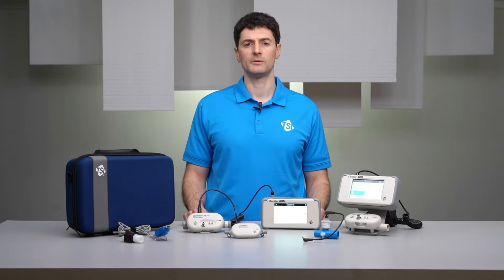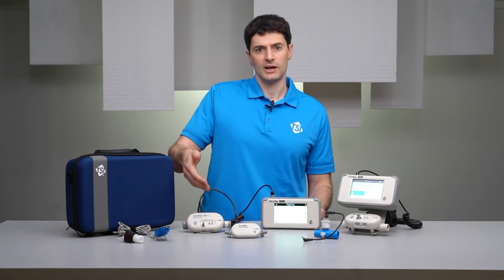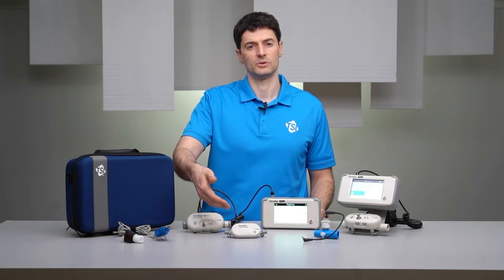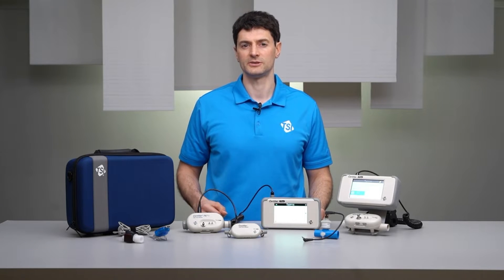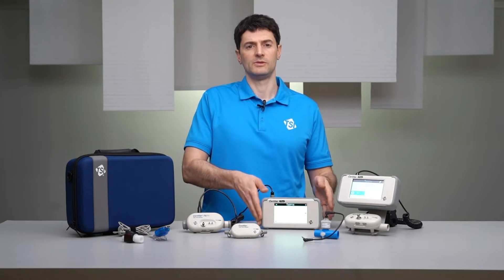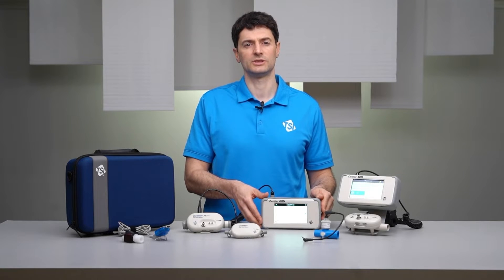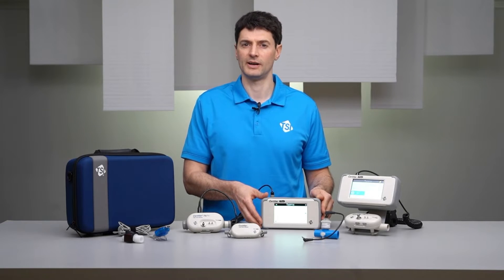The Certifier Plus test system employs a unique modular design that splits the measurement and user interface into separate components. The high flow and low flow modules contain all the sensors and make the measurements. Flow modules connect to the interface module, which powers the flow modules, displays readings, and provides user control.